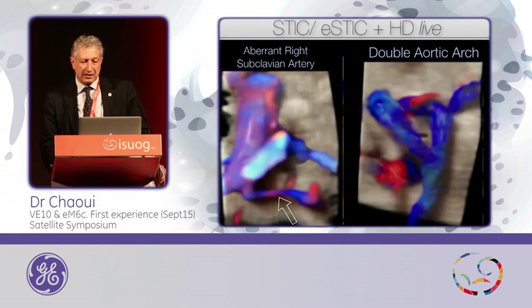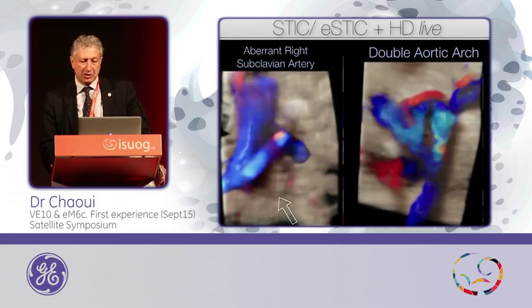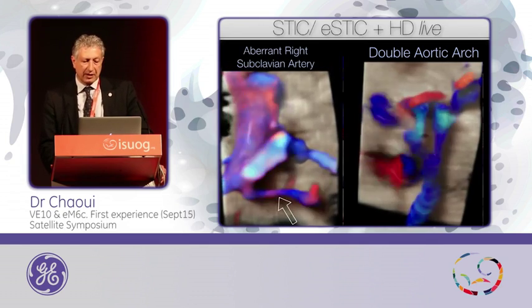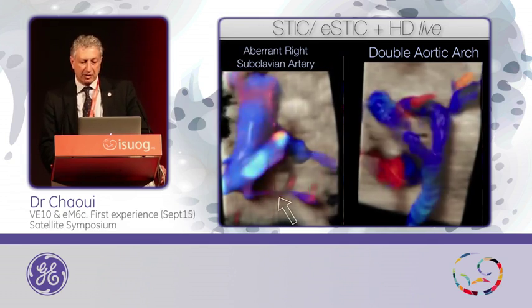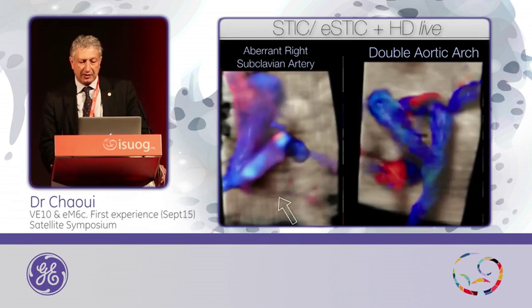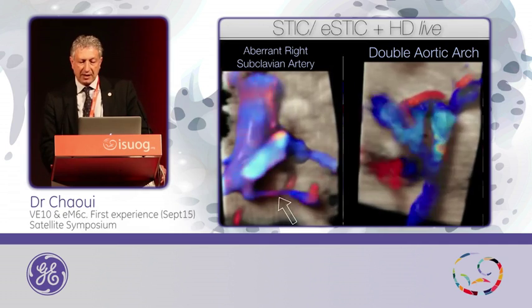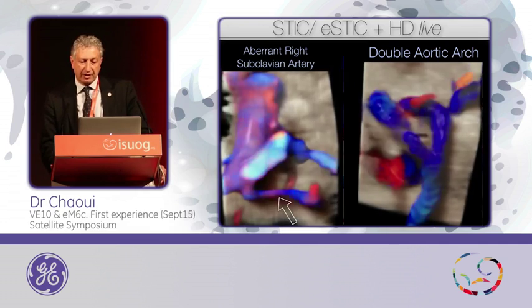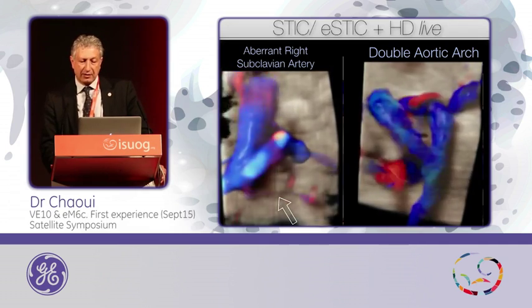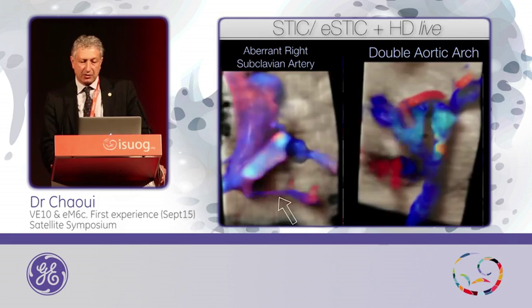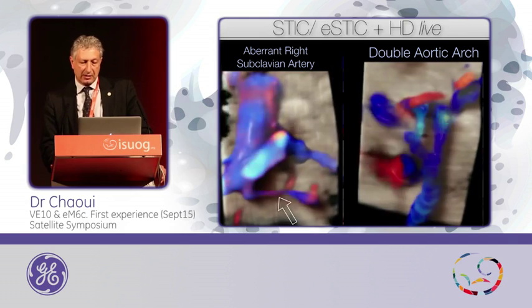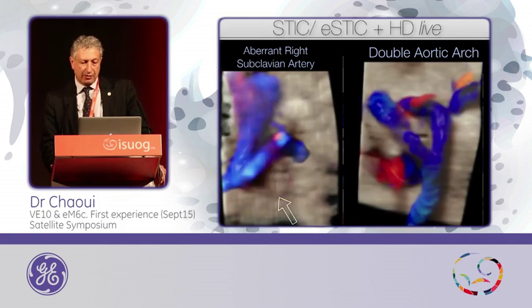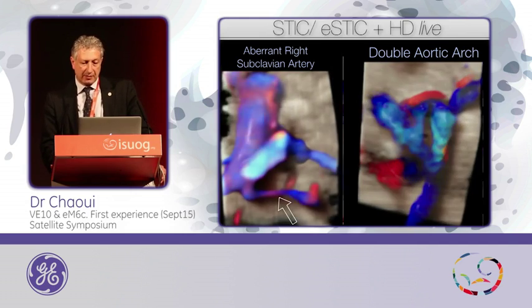And for tiny vessels — the ramification of the aortic arch — here is the aberrant subclavian artery, and this is the double aortic arch. You see the right arch, the trachea, the left arch, and the ductus arteriosus as the third arc in this plane.